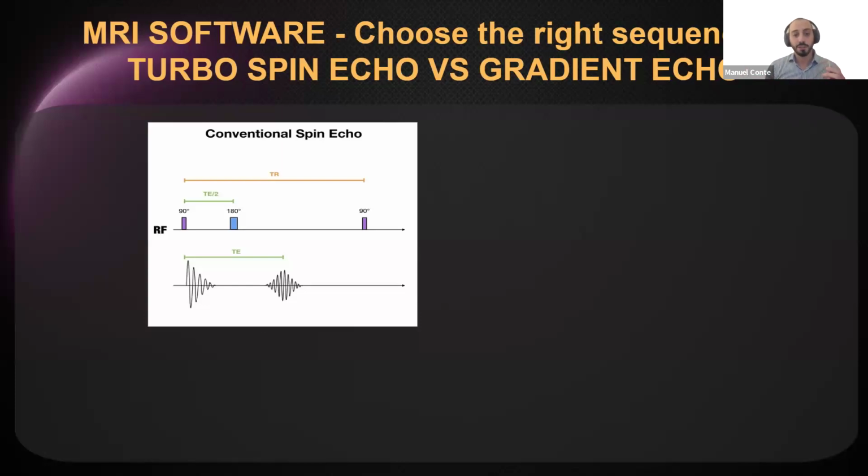The parallel direction is low energy, anti-parallel is high energy. We know that the number of parallel protons is higher than anti-parallel protons. So the net magnetization vector is formed by parallel protons, which have the same direction as the magnetic field. At this moment, they are out of phase.